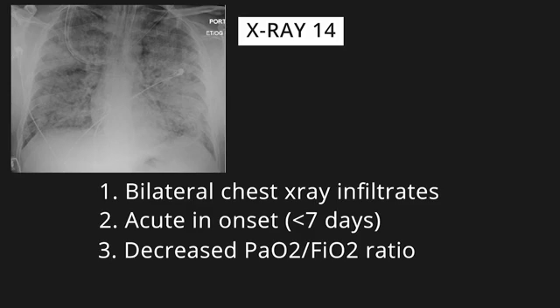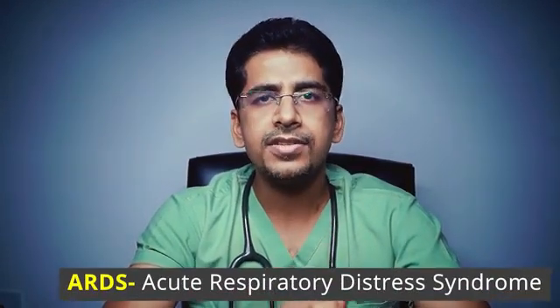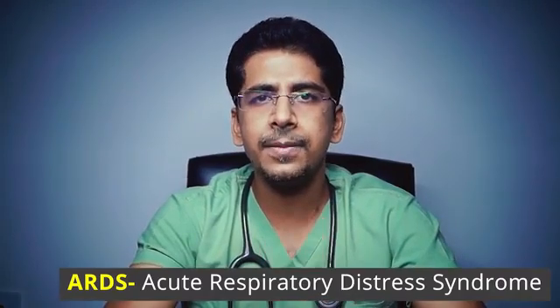I mean there is decreased oxygenation as suggested by 80% oxygen support, that too from a ventilator, and there is no cardiac issue. So this is a classical picture of ARDS, acute respiratory distress syndrome. Very, very, very important.